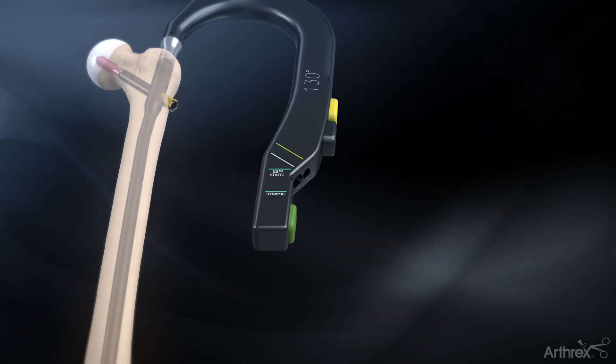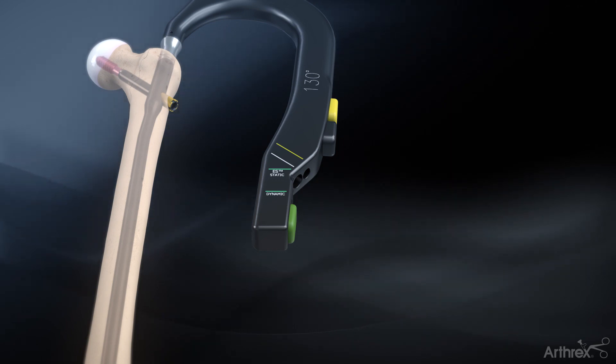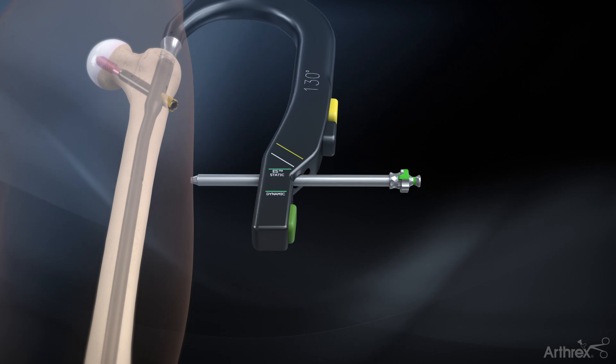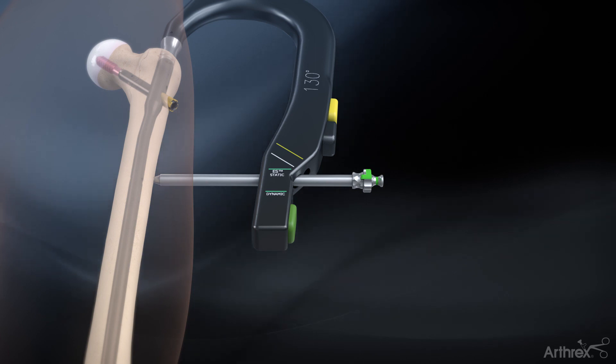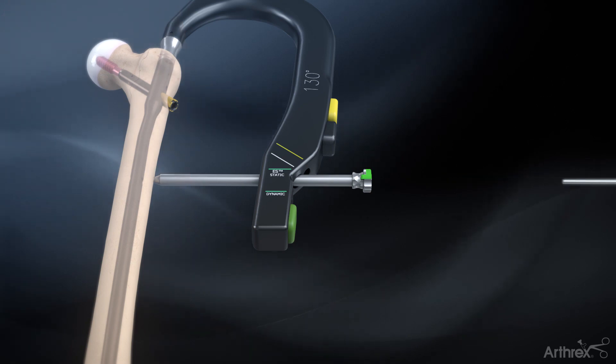For the ES trochanteric nail and short trochanteric nail, distal locking is performed through the targeting module. Place the distal screw triple sleeve assembly through the appropriate distal hole in the targeting module and mark the skin. Make the incision and advance the distal screw triple sleeve assembly to the lateral cortex of the bone. Remove the distal drill guide obturator.